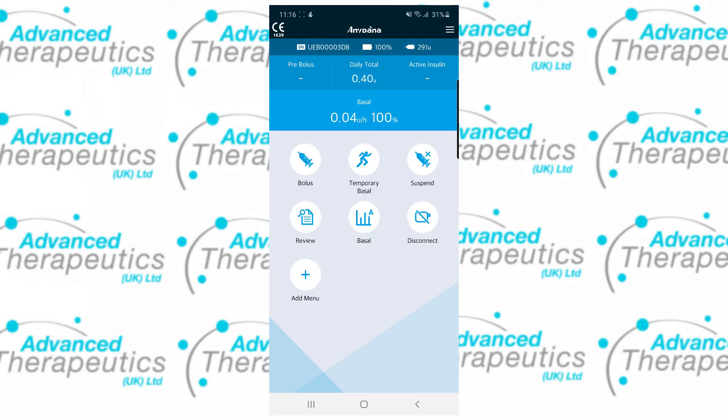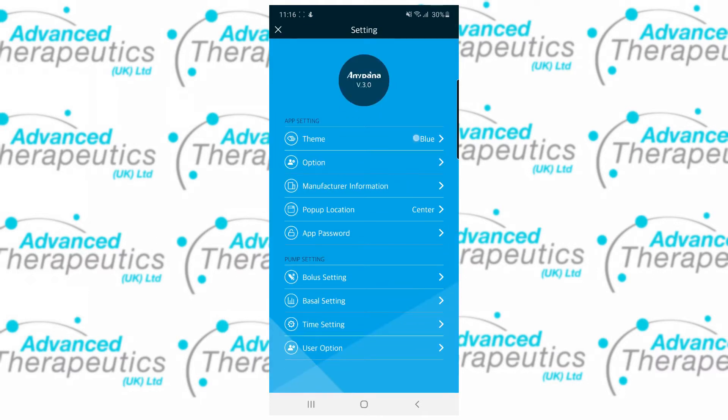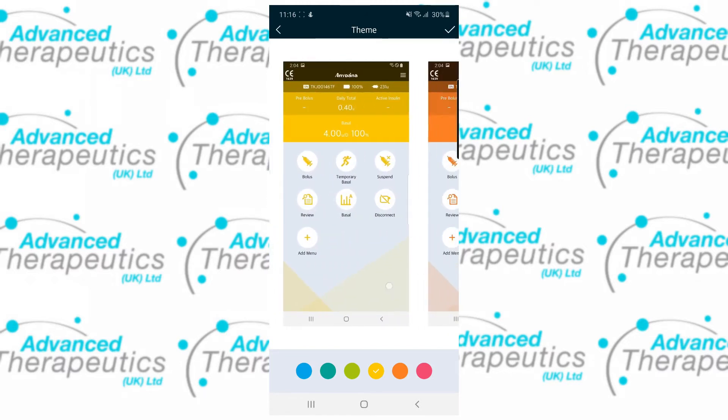Tapping the button up in the top right of the phone app will take you through to the main menu screen. Here you'll find quick access to lots of settings, both pump specific and app specific. The top option, Theme, allows you to change the colour scheme of the app.